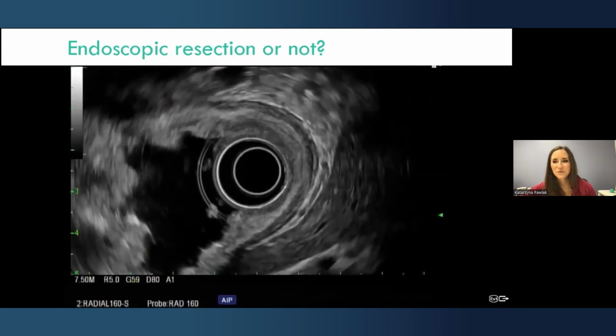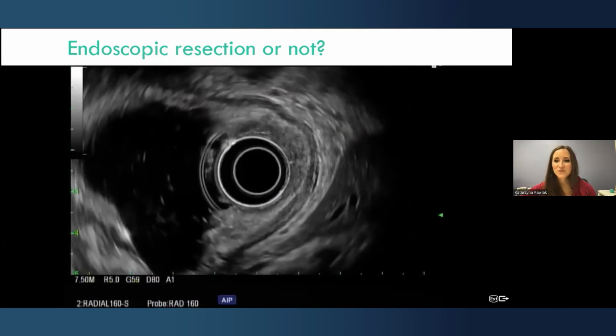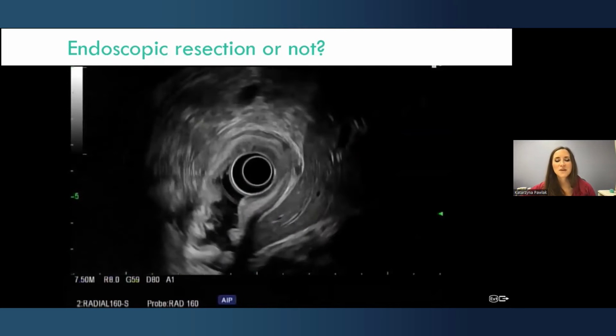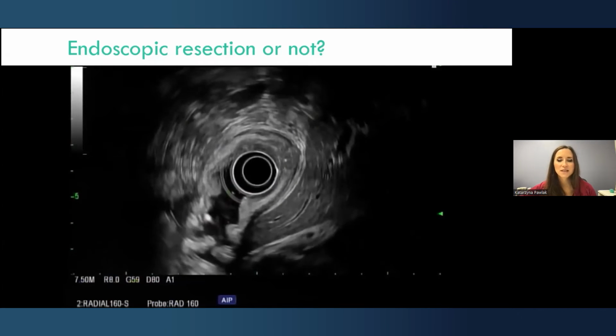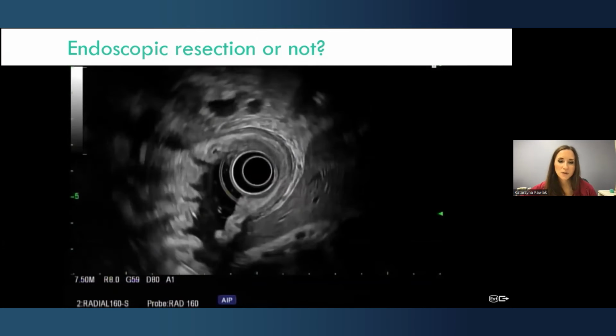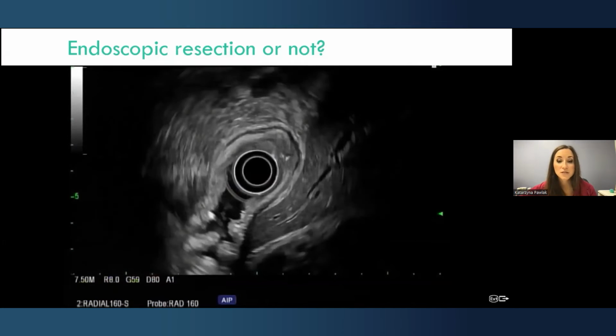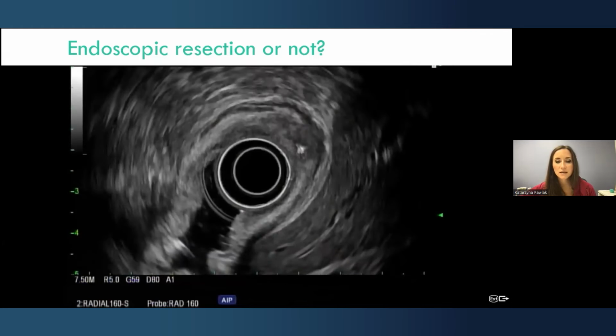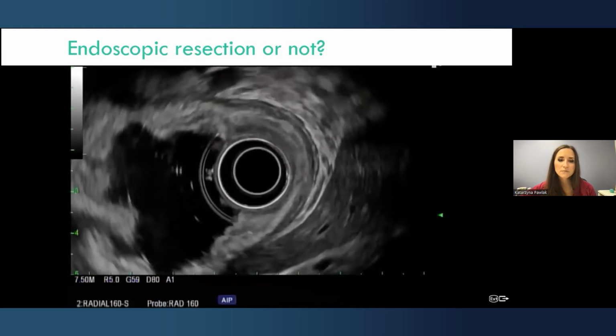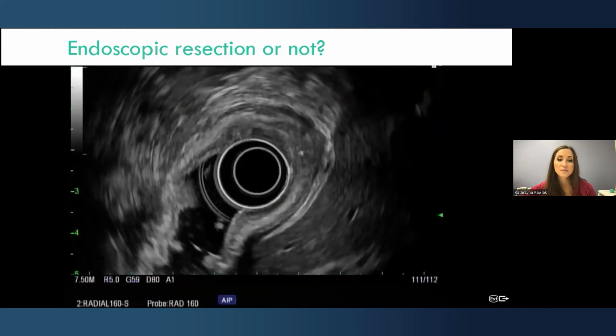So I want to ask Paris and Professor van der Merwe then, maybe after the session, after the presentation, what type of lesion that is, if it might be assessed or referred for endoscopic resection. But aside from that, you can see that the balloon is not distended so much. And also the air was removed as much as possible.